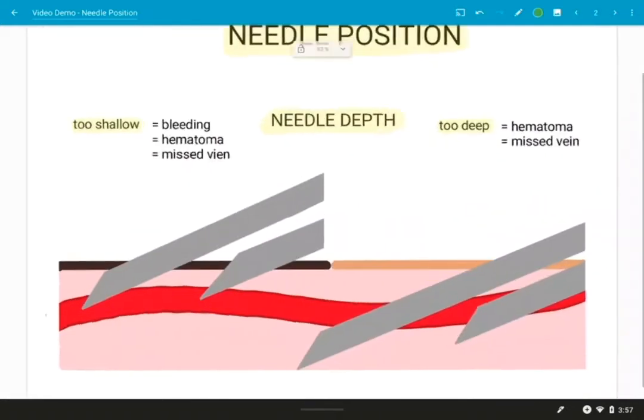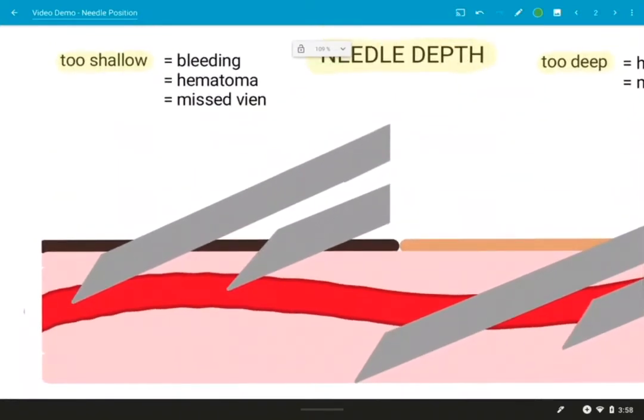Okay, let's talk about what happens if your needle is too shallow. It can cause bleeding, hematoma, or a missed vein. Let's go over the hematoma first.